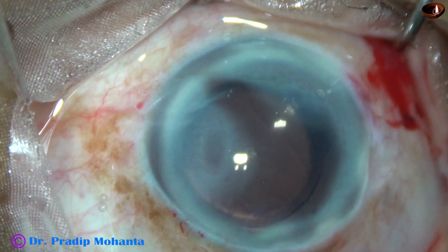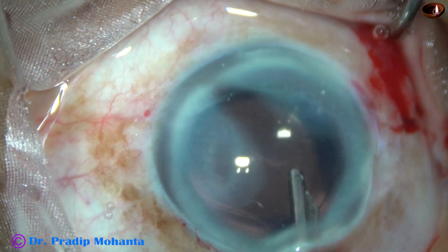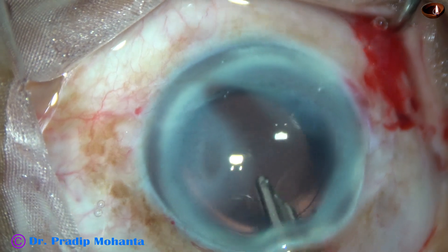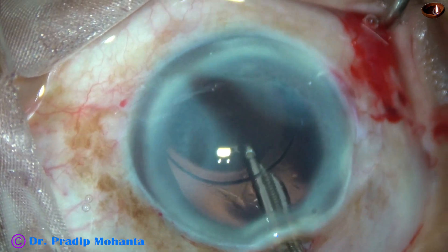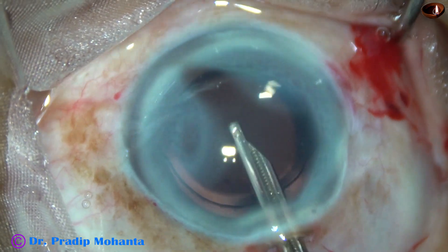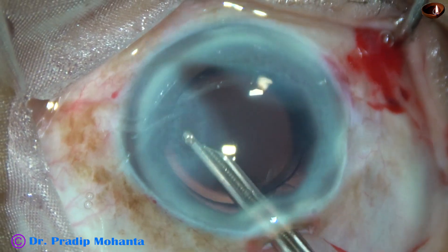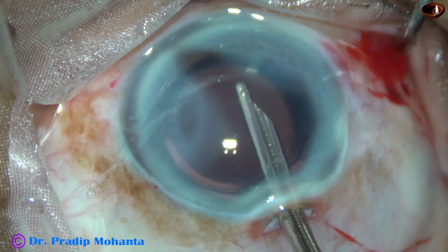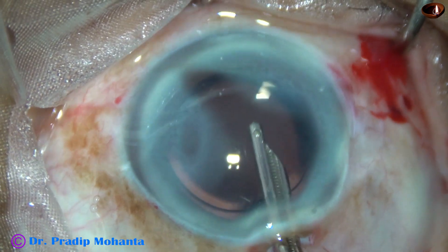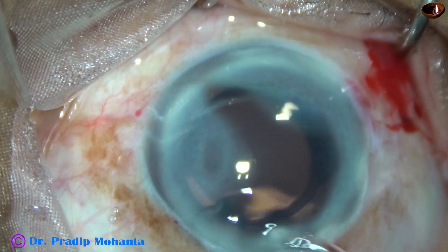Now visco cleaning has to be very thorough because retained visco can cause increase in intraocular pressure. There can be steamy corneal edema and the patient may be very uncomfortable the next day and during the night. So whenever we are using visco, we must remove it very nicely. We must devote some quality time to remove this.